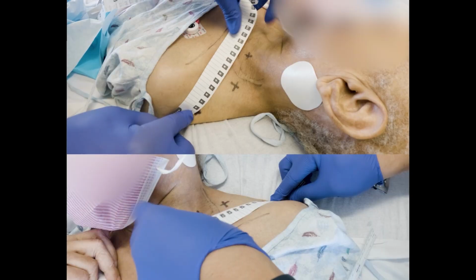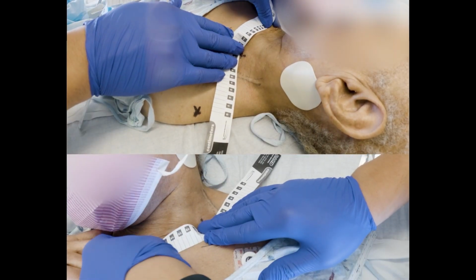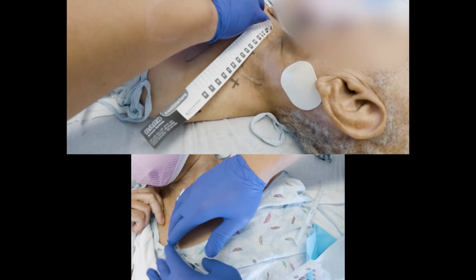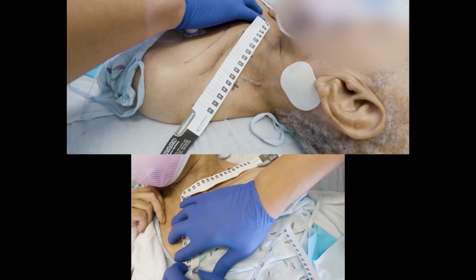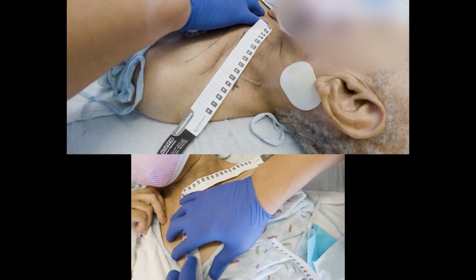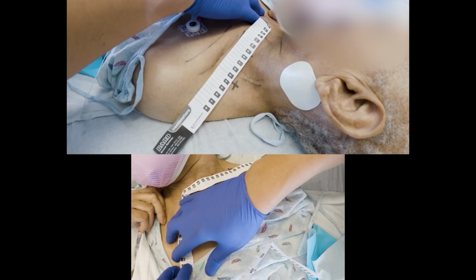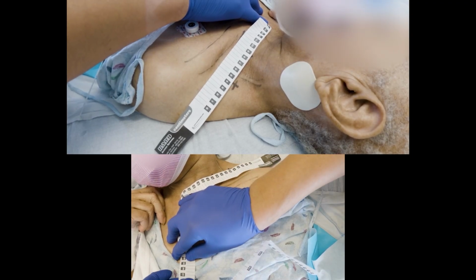Okay, so you want to measure from your intended exit site. Let's see, from here, it does dip down a little bit to about, let's say, 18 centimeters. And then 1, 2, 3 intercostal spaces lands us at about 28 centimeters. 28 plus the secure cath, 1, 2, 3, 31 centimeters.